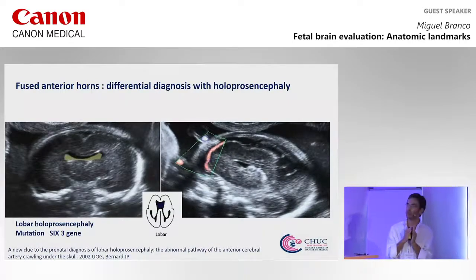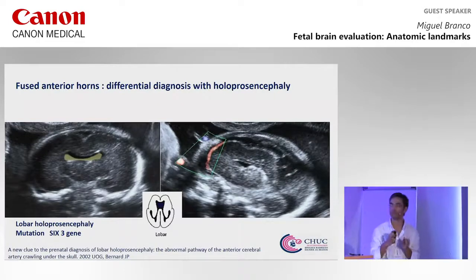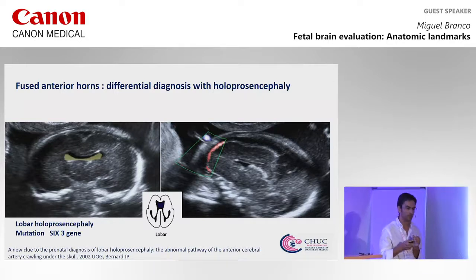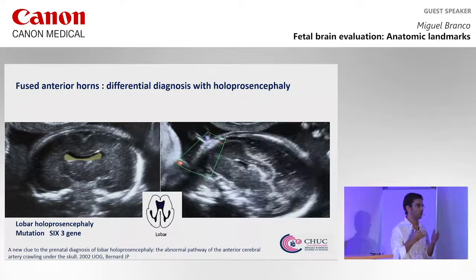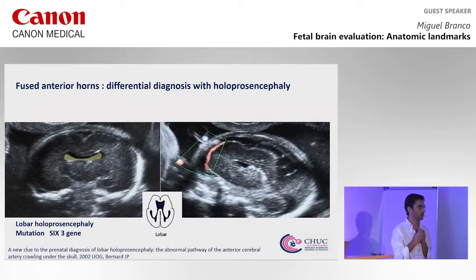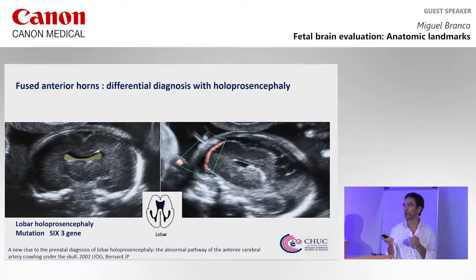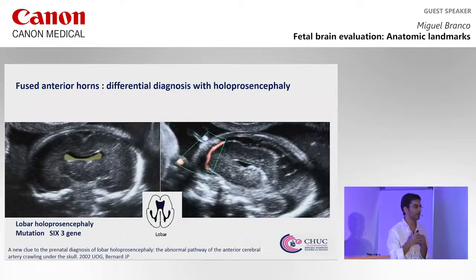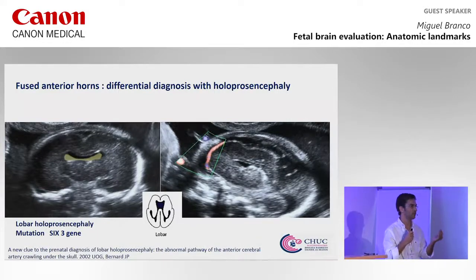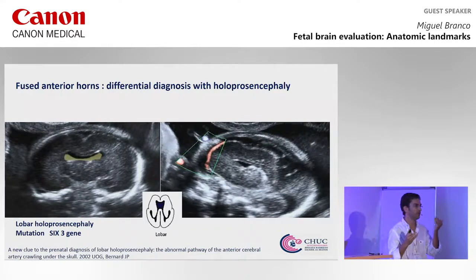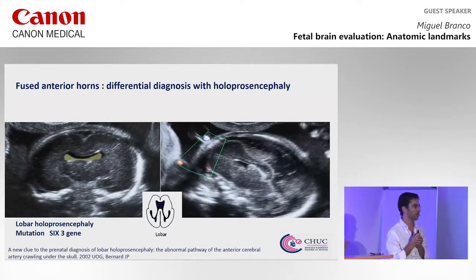Another differential diagnosis for fused anterior horns is lobar holoprosencephaly. In this situation we have no normal corpus callosum and incomplete interhemispheric fissure. On the right we have a typical sign where the cerebral artery runs under the skull, because the interhemispheric fissure is incomplete on the anterior portion.